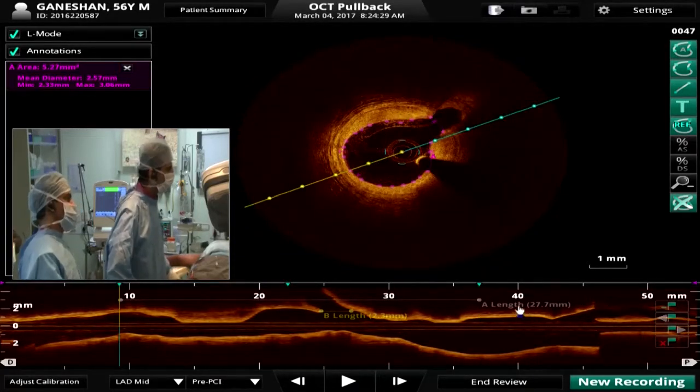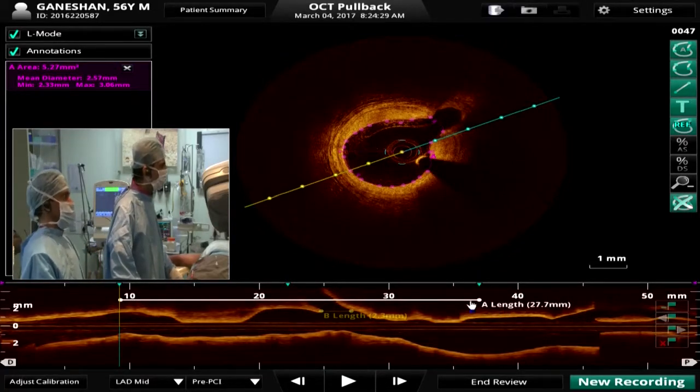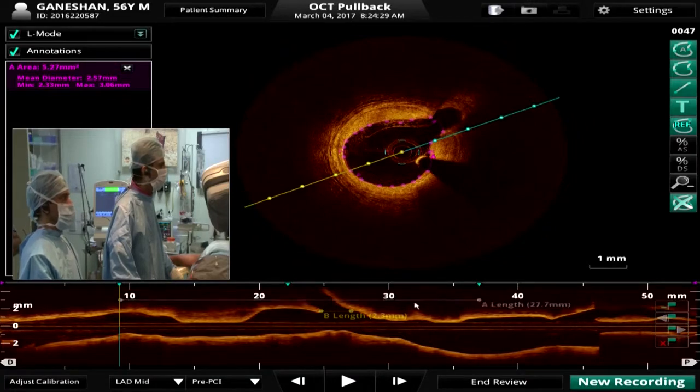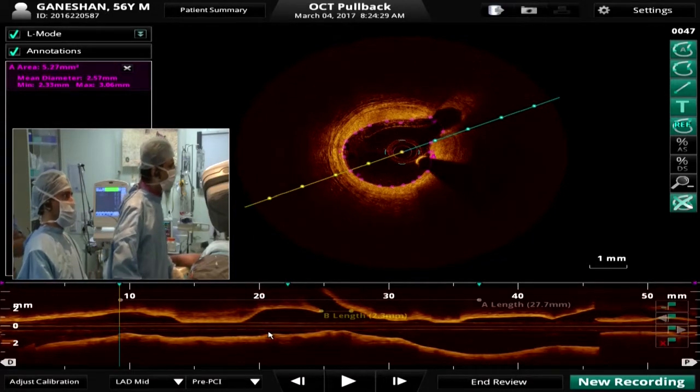One or two stents? Or can we use a stent at the borderline, somewhere around where the vessel size is 3 and the LAD is tapering? We can start from there and put it distally where it is 2.5. So we can choose a stent of 2.5 and inflate it up to 3 and 3.5. So don't go to the LAD where it is 4. We can keep it slightly distal. One can consider a bottled stent. Yeah, we can do that, but what type of stent are you suggesting?